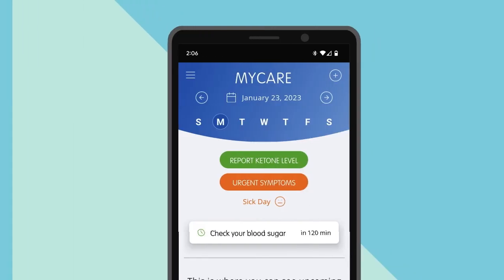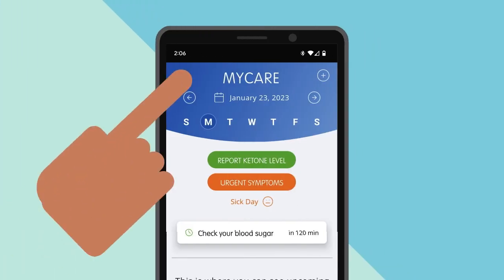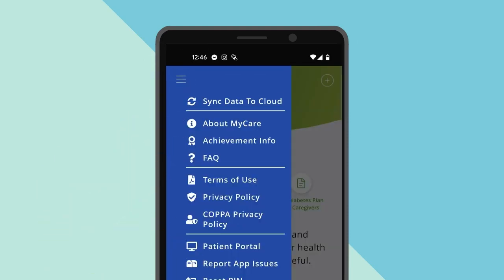If you click on the top left corner, shown here, you can select from options to sync your data to your cloud, access our about page, keep track of your achievements, explore the facts page for more information about the app's functionality, access your patient portal, and more.